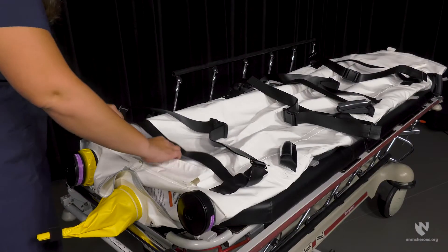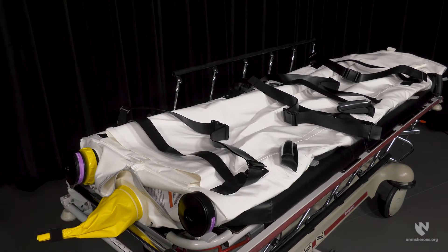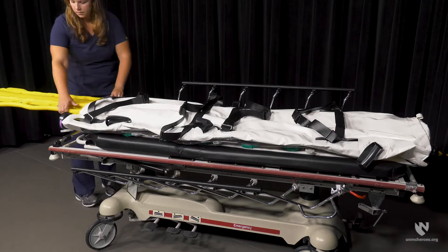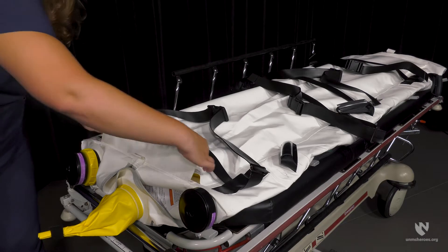To place the spine board in the isopod, open the velcro flap and slide your spine board into the pocket. Once the spine board is in place, velcro the flap back into place.